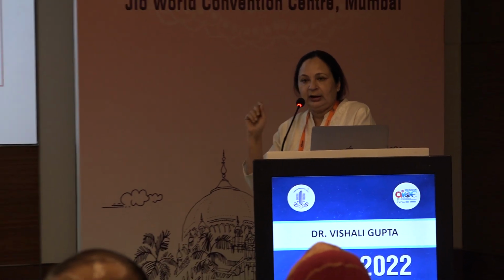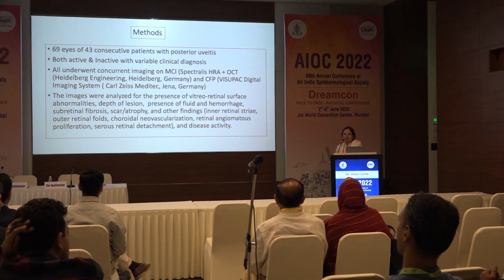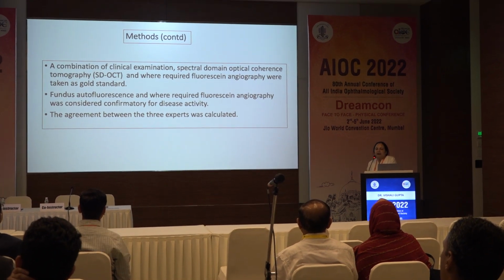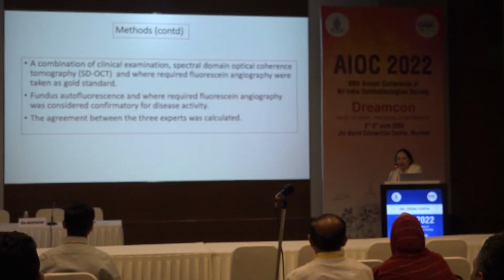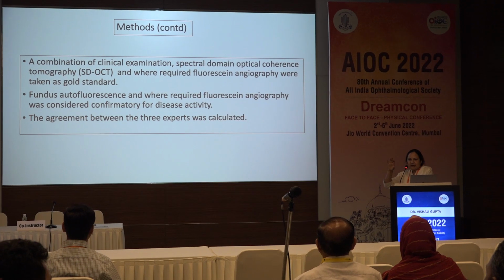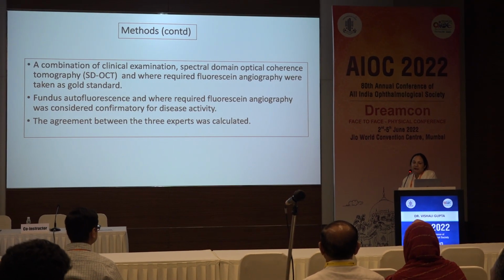After acquiring the patient images, a clinician who was blinded to the imaging data evaluated whether it was active or inactive, and they gave their comment. Then there were three of us, me, Anirudh, and his lovely wife Kanika, and Kajri showed us all these blinded images, and we believe we have a lot of experience in uveitis.